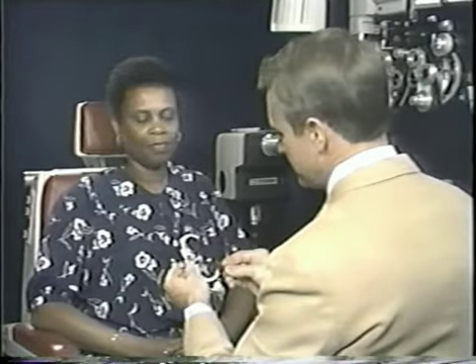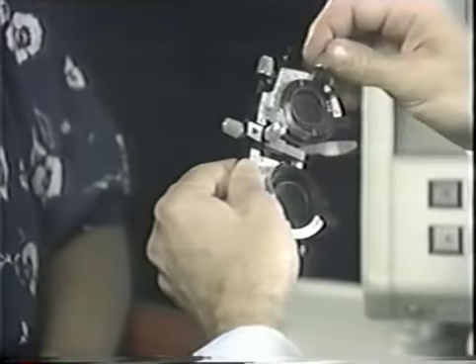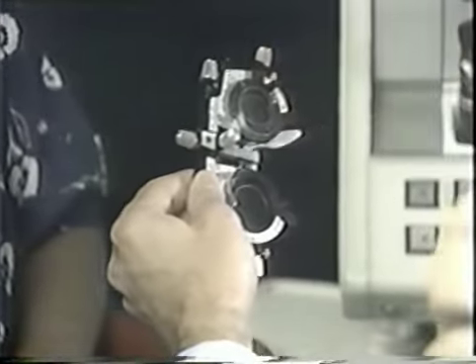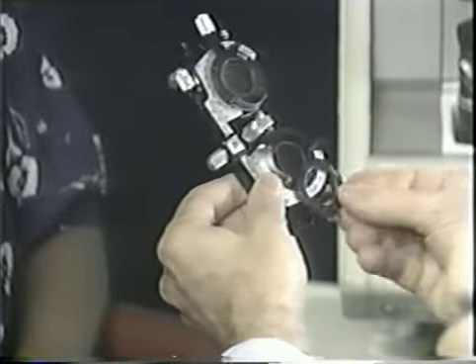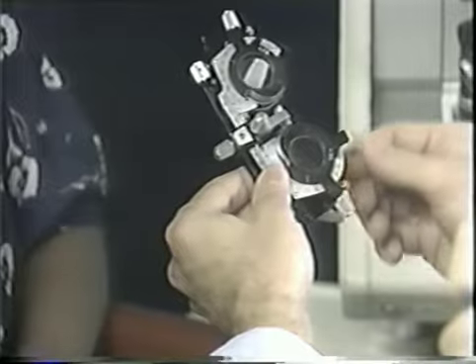An important part of the subjective refraction for presbyopes is the determination of the necessary power for reading adds. Many methods are used to determine reading adds. We will only describe the simplest method here. There is a reading card that flips down on the phoropter, but many practitioners prefer to use trial frames to allow the patient to read in down gaze.